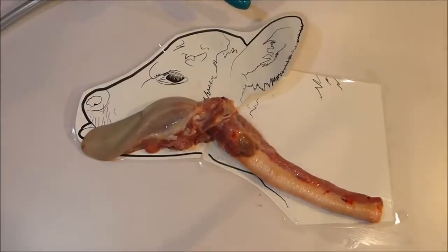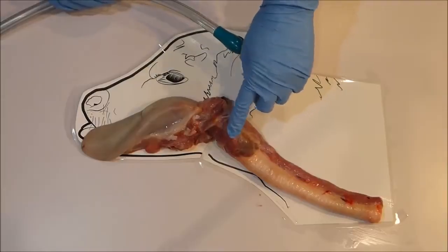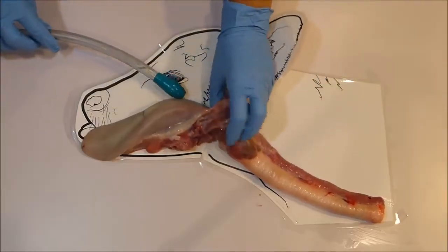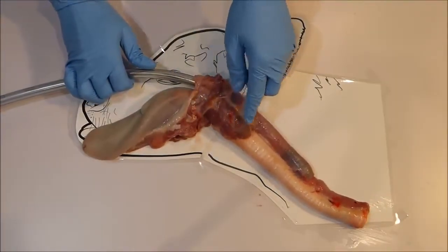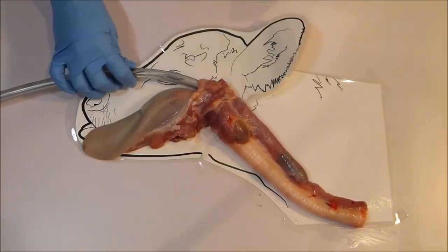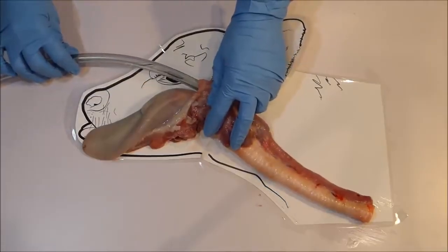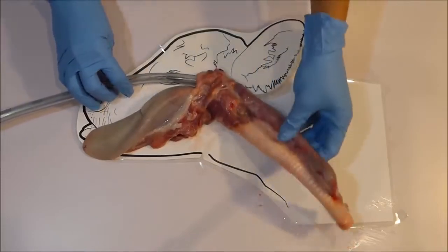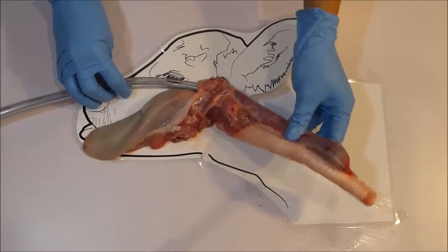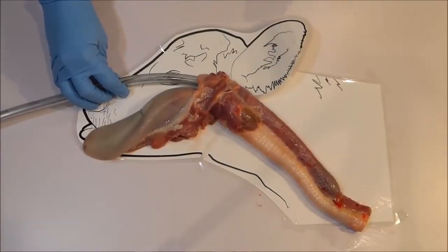Our next important point is to always ensure you pass the tube far enough. The tube needs to reach a safe distance past the airway entrance and stay there the entire time fluid is flowing to ensure liquid does not access the airway entrance and end up on the lungs causing drowning. If you are concerned about not passing the tube far enough or accidentally pulling the tube out during feeding, then simply pass the tube further down. Because this tube is flexible, you will not do any damage and passing the tube further is far, far better than not passing the tube far enough.